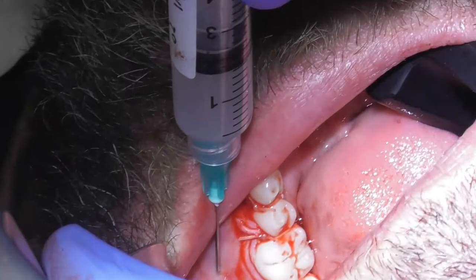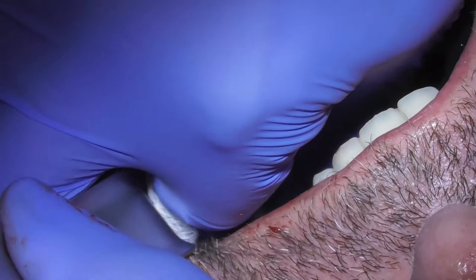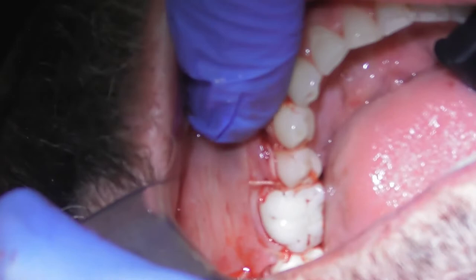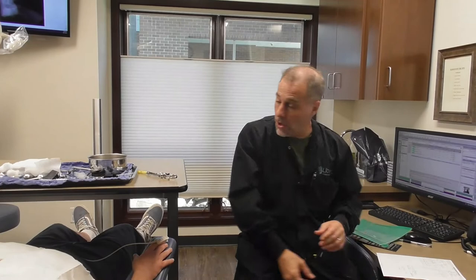We're all done now. Just for the camera I'll put my finger here and hold down the tissue — you can see it's a little puffy because of the procedure and the local I just gave, but that bump is gone and it's all just baby-soft and smooth in there. We'll pack this with gauze and bite down — you are done! I will call you later this afternoon to see how you're doing and you have some medicines to take.